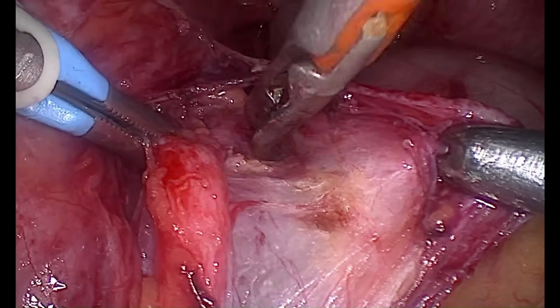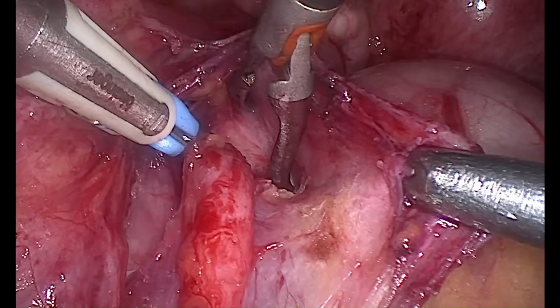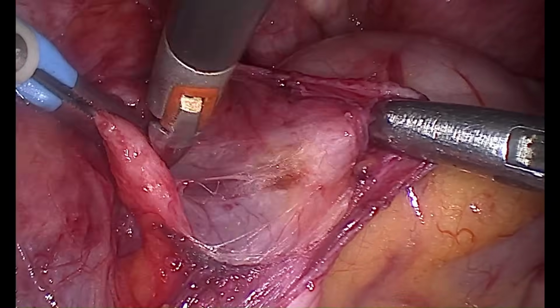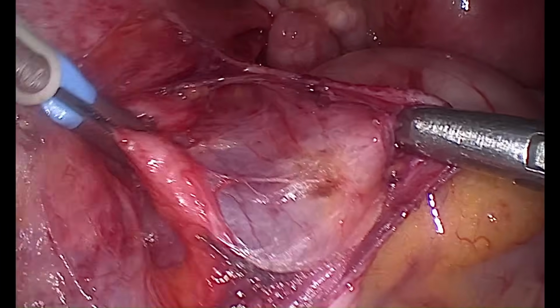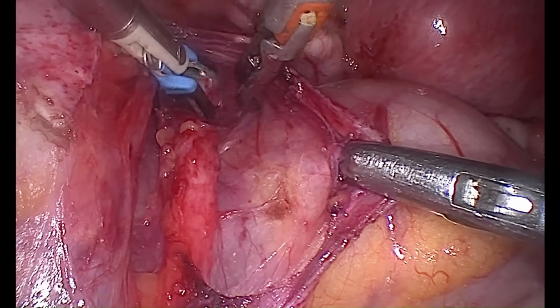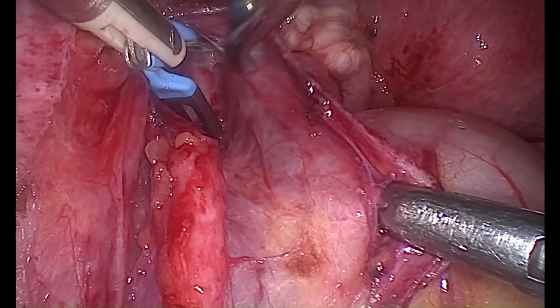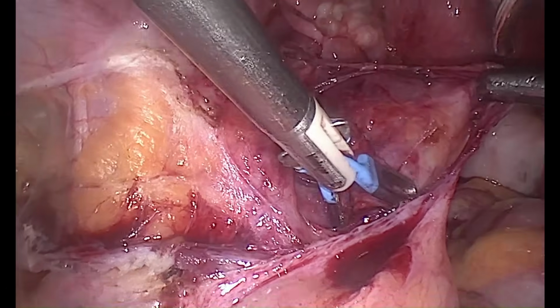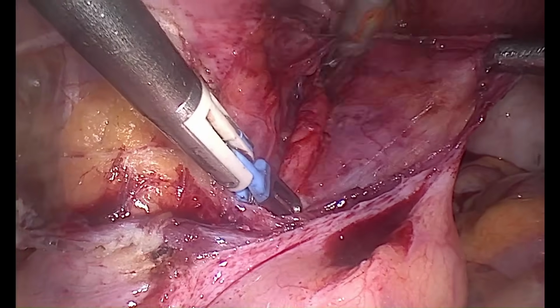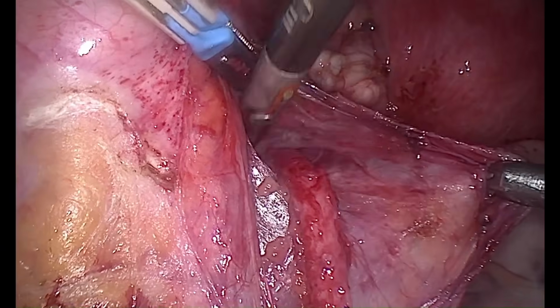Sometimes people think that using a stent is an easier way to do a ureterolysis. But in our institute, we never place a ureteric stent prior to the dissection, because the stent makes the ureter less pliable and the dissection becomes very difficult. You can see we are going parallel to the tubular structures, and this is always a dictum. You need to be parallel to the tubular structures and not perpendicular, so that you do this dissection without causing any harm to the vital structures.